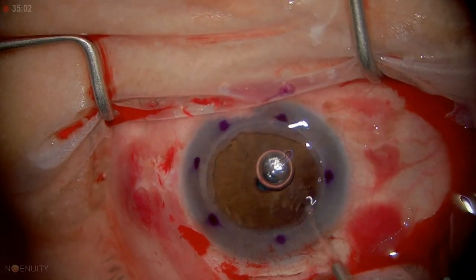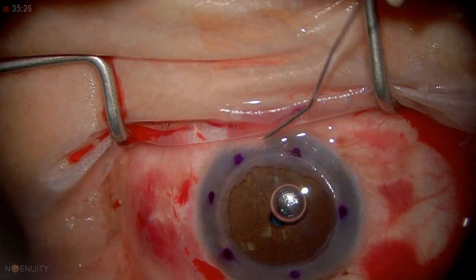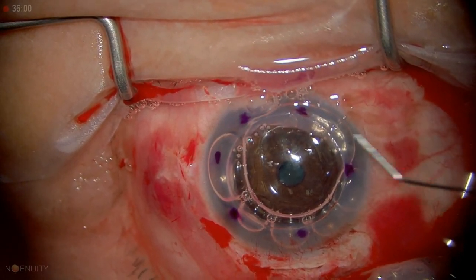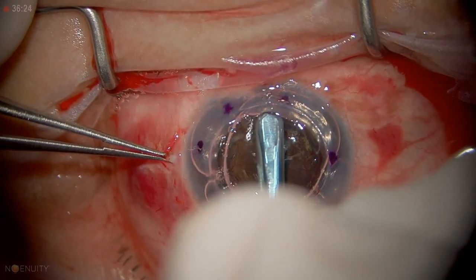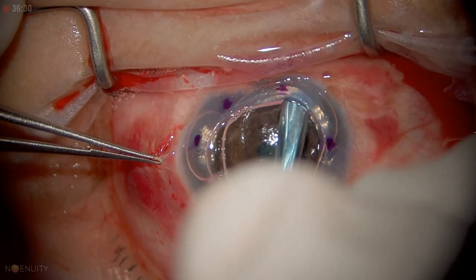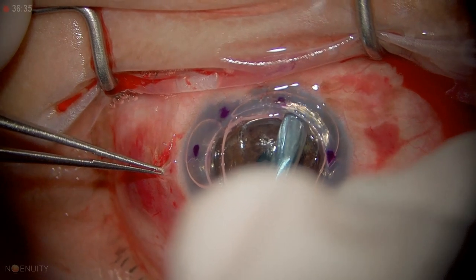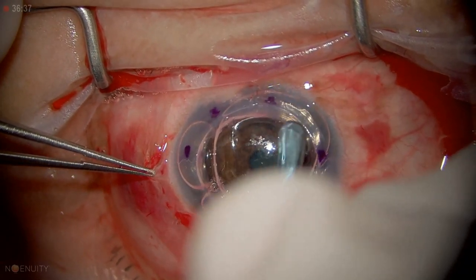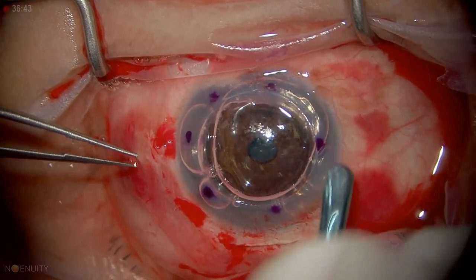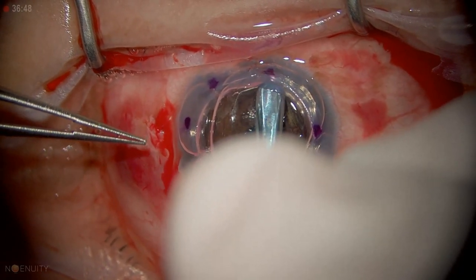The depth is beautiful — we can see the depth is great. But this ring is not ideal. So how do we fix that? I'm going to put some more air in and just dissect this a little bit more. That's creating a little more gap under here. It's going to create some overlap so I'm able to leave that little rim of tissue and just suture into it — it'll get pushed back into that space like a little bit of a tuck.